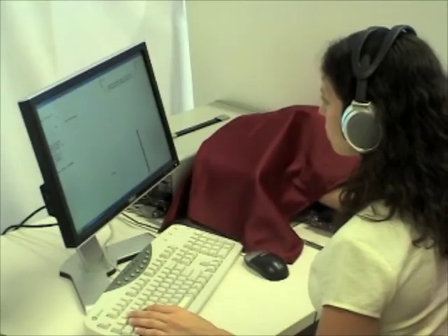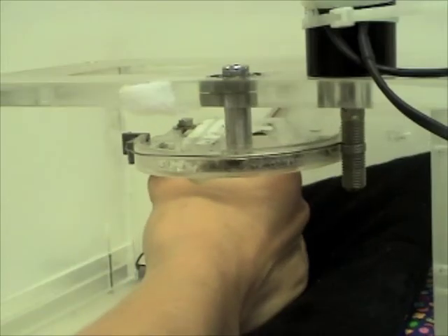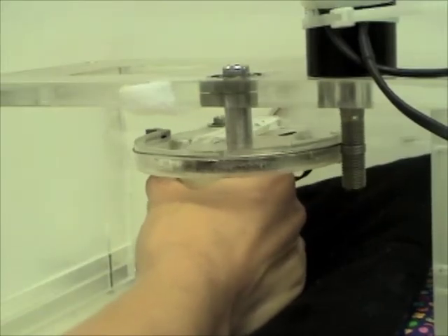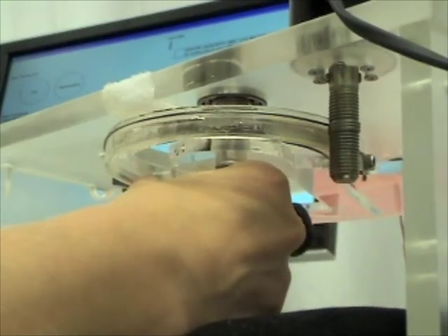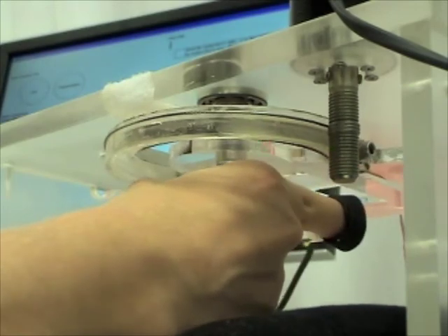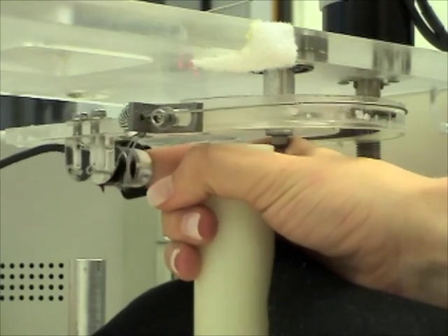The objective of this study was to quantify the role visual and proprioceptive motion cues play in a discrimination task to better understand the role of vision and proprioception in upper limb prosthesis use. We designed an impedance-controlled testing apparatus that allows able-bodied users to manipulate an analog to an ideally responsive and controllable prosthesis. The apparatus enables comparison of artificial and real limb use in a spring discrimination task with and without sight.